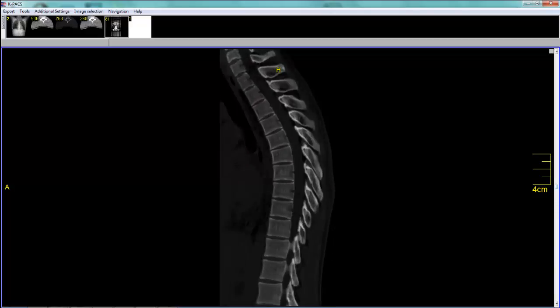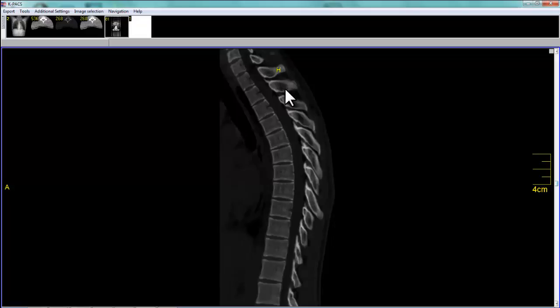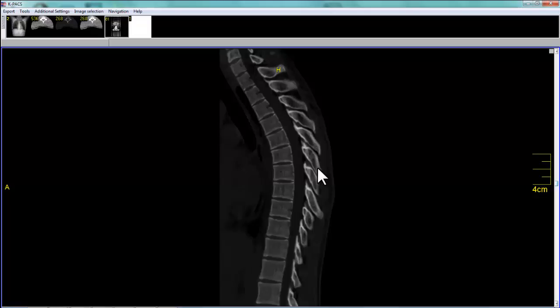One more thing you'll see is that posterior to the spinal canal is your spinous process. This is a spinous process here, spinous process here — at each level you'll see a spinous process. That's just a general anatomic bony overview.